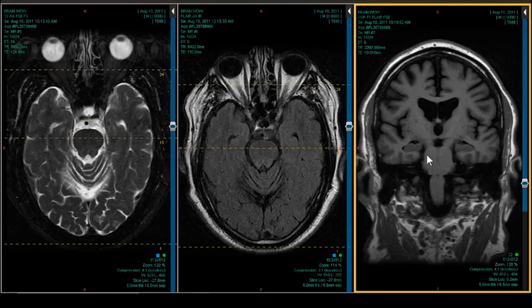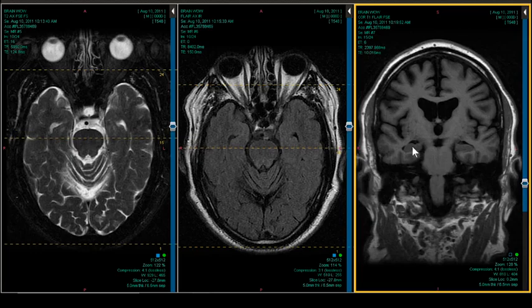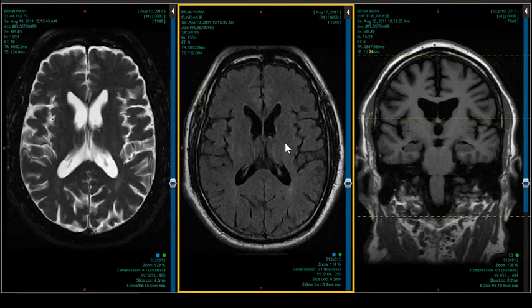Because that's the most common neurodegenerative disease, would be Alzheimer's: temporal horn, parahippocampal, entorhinal cortex atrophy. And here's the entorhinal cortex. Right here, not that bad. In fact, it's pretty juicy. So we're not talking about Alzheimer's, right? That's the wrong pattern. That's a big deal. Okay, so what are we talking about?